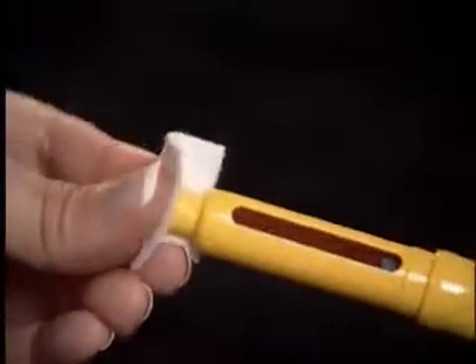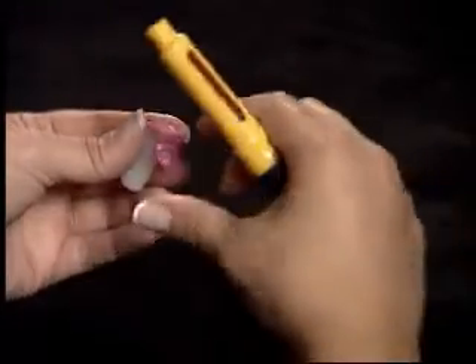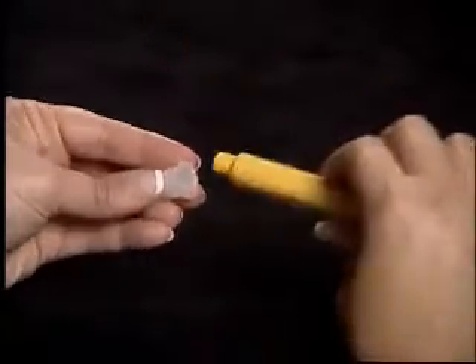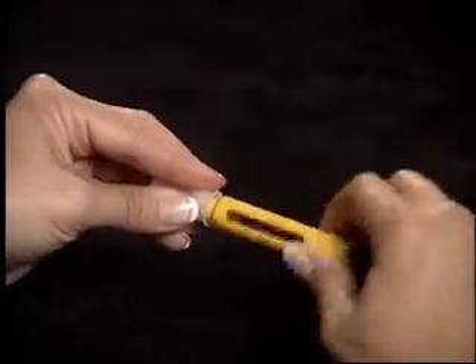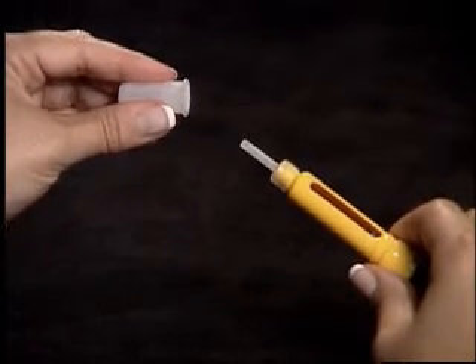Clean the end of the cartridge holder with an alcohol wipe. Attach a BD Microfine Pen Needle and tighten by twisting. Remove the outer needle shield and do not discard.